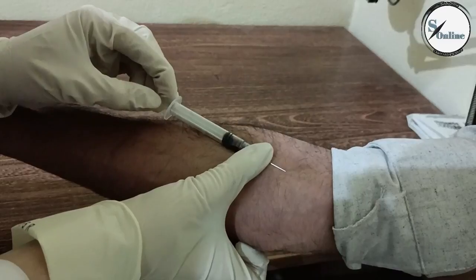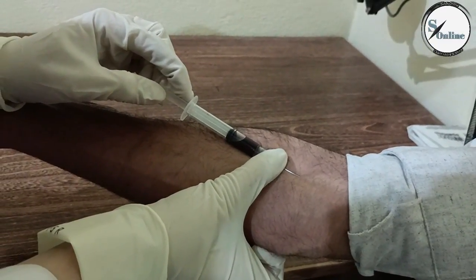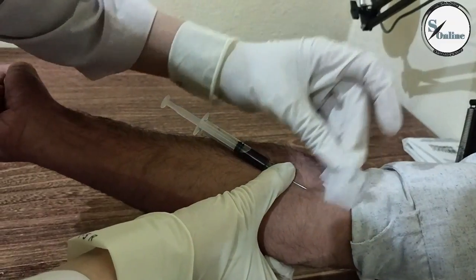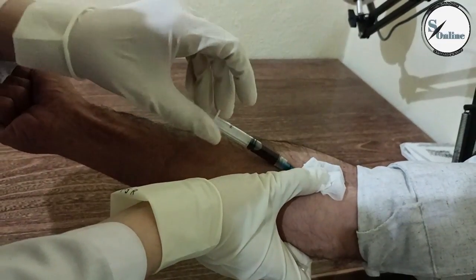This is called blood. Look at this — it looks like blood. Look at the blood samples from your field. Now we will put it here and place the syringe in a safe place.